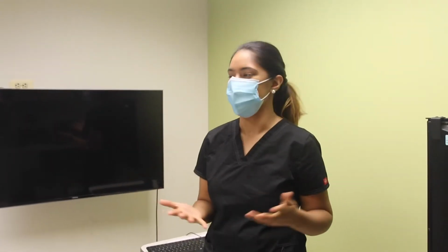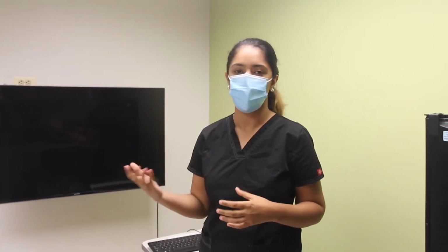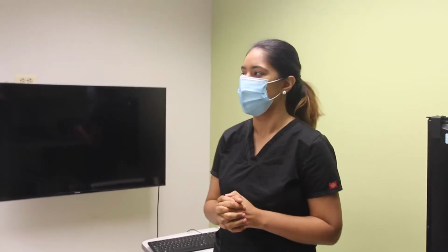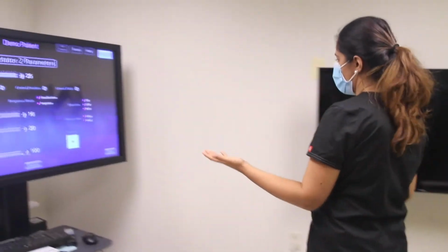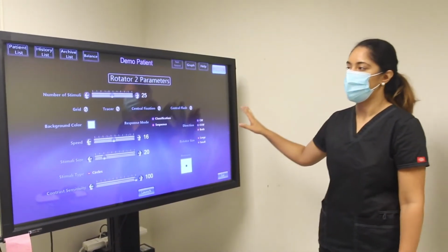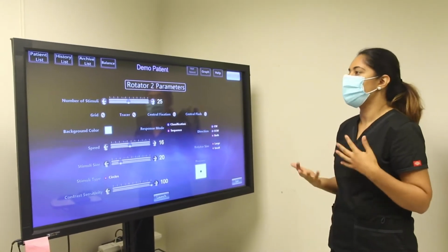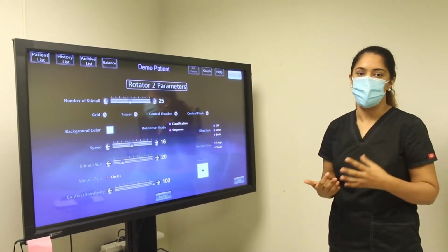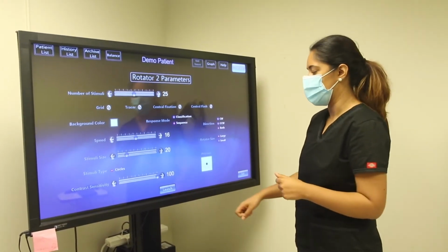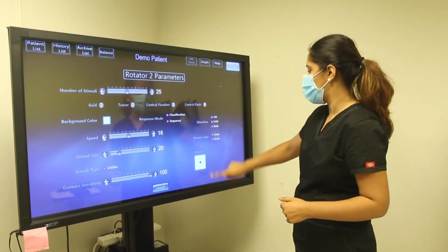This is Vision Therapy Room number 3, where we basically use screens and virtual systems to help our eyes work together. This is one of our, it's called an SVI, and it helps our eyes move together. It's called saccadic movement, very important when we're trying to read. So it helps our reading abilities, especially important for children to make sure their reading abilities are the strongest, especially growing up. So I can demonstrate how one of them works.